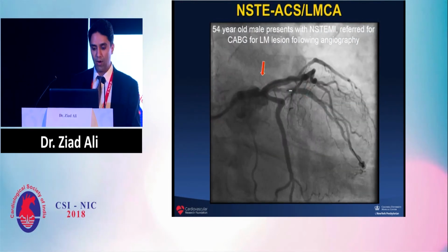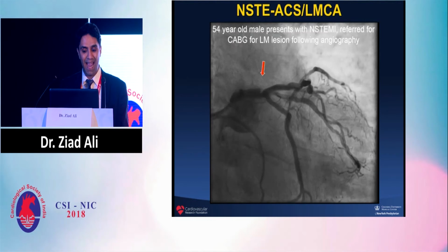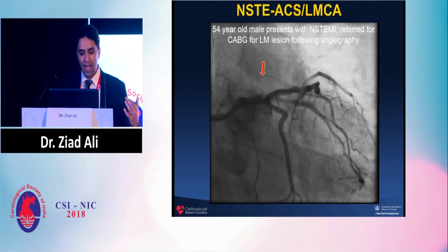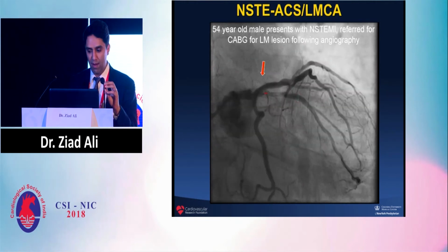Another case where one of my colleagues was on the telephone with the surgeons referring this patient for CABG following identification of this left main lesion, where we actually convinced them to say, well, let's perform an intravascular imaging because of a hazy appearance in the ramus.